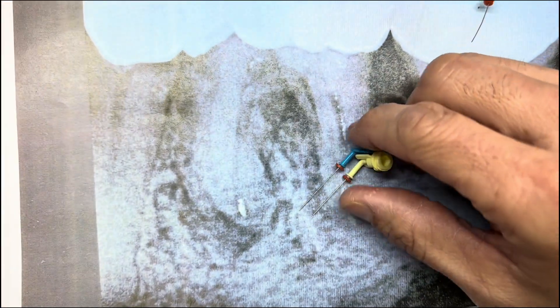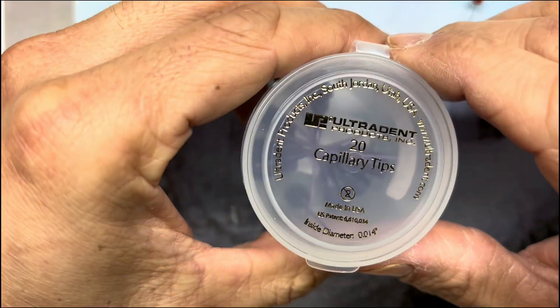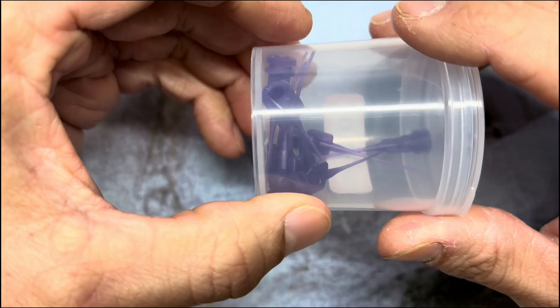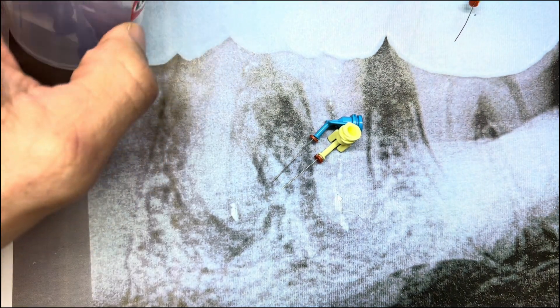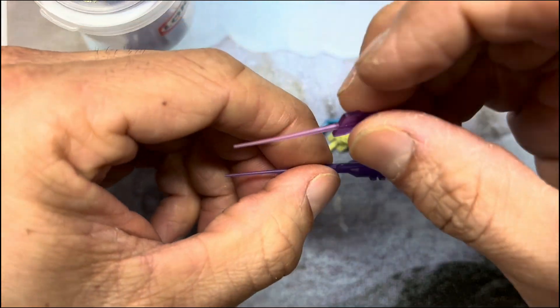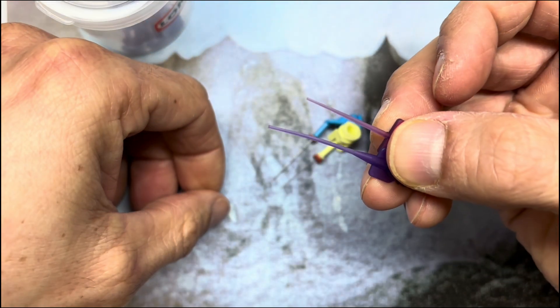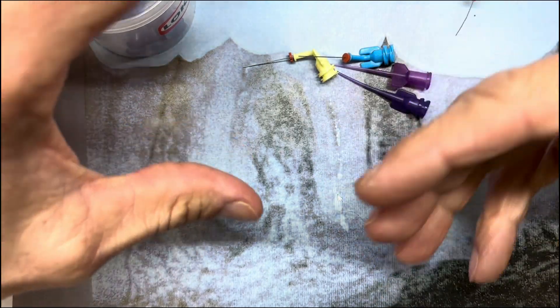These NaviTips come in a whole bunch of different sizes — yellow, blue, green. You can also use capillary tips; they're not as small, a little bigger, around 0.5 millimeter. The sky is the limit in terms of tip size you can use. So using suction to try to pull that debris out is one option.